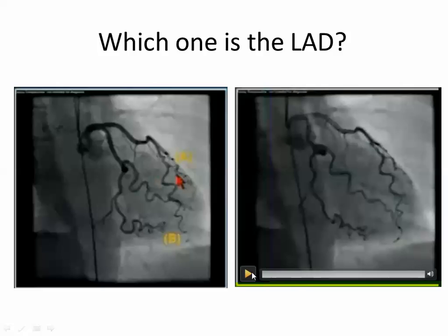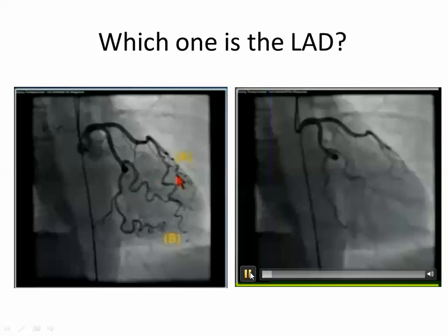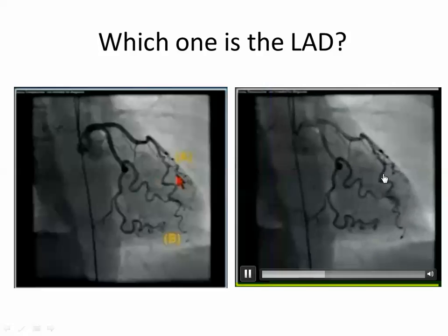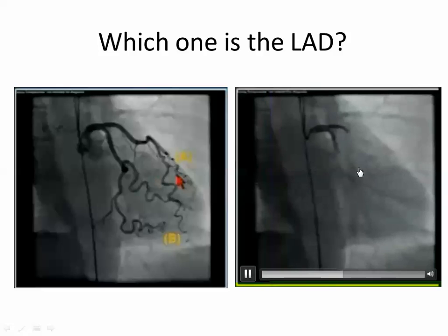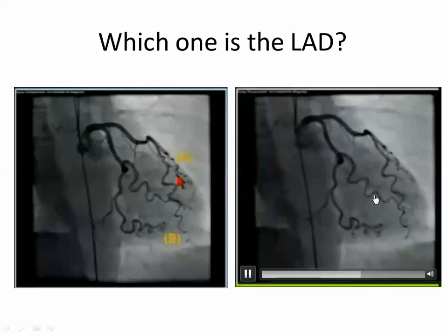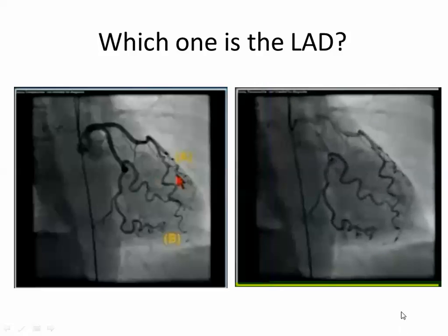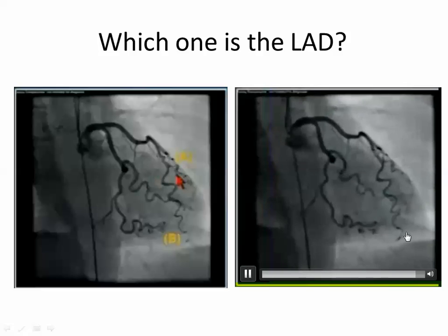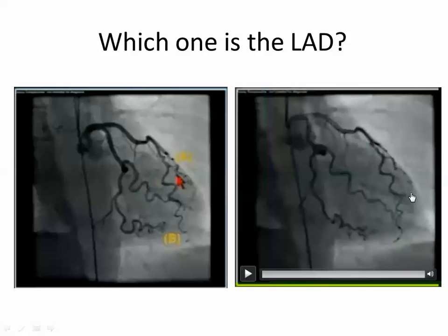You show the film and say to me which is the LAD. This or this or this? This? Yes. Why not this? And this is also going to the apex.